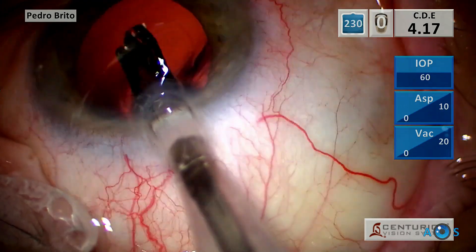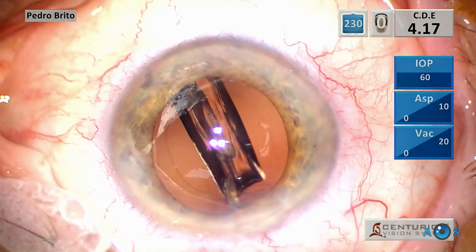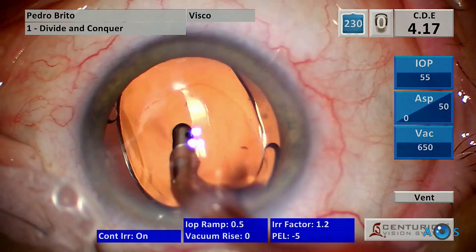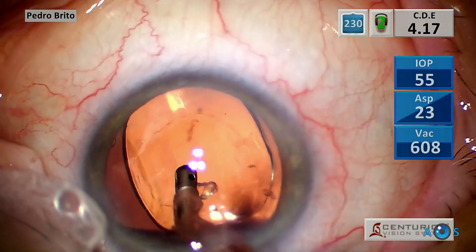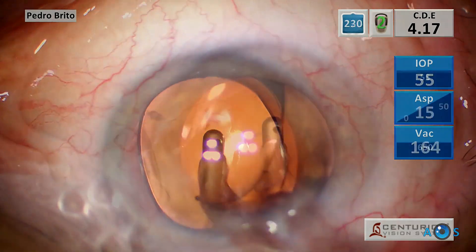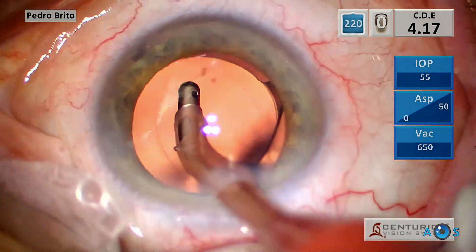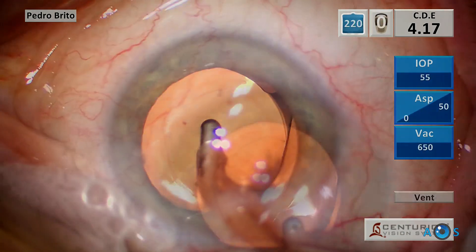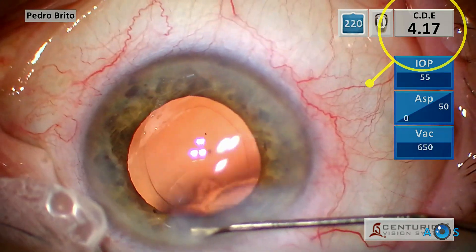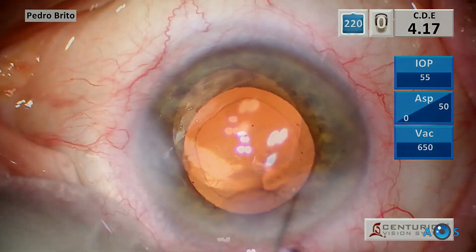It is now ready to implant the intraocular lens. The OVD is now removed from over and under the IOL as the case is now completed. Notice that the improved FACO energy modulation and fluidic dynamics allow the safe removal of this Grade 2 cataract with a very low level of cumulative energy used.